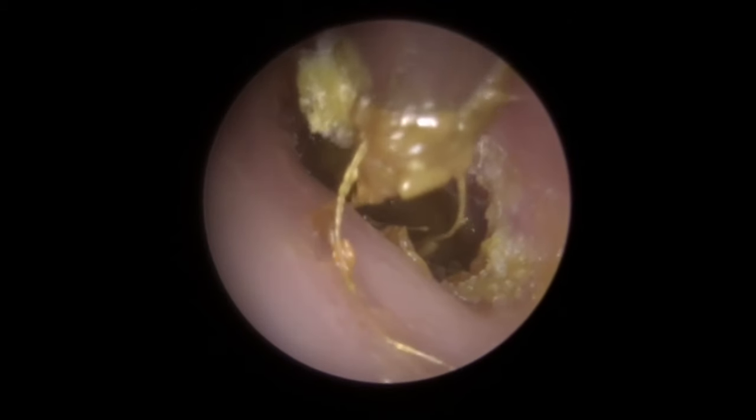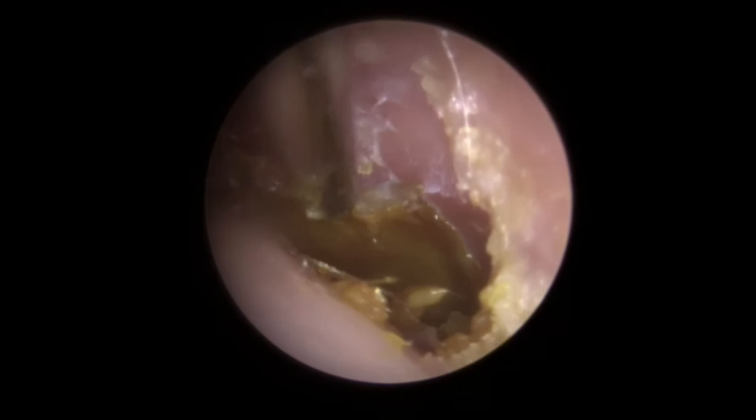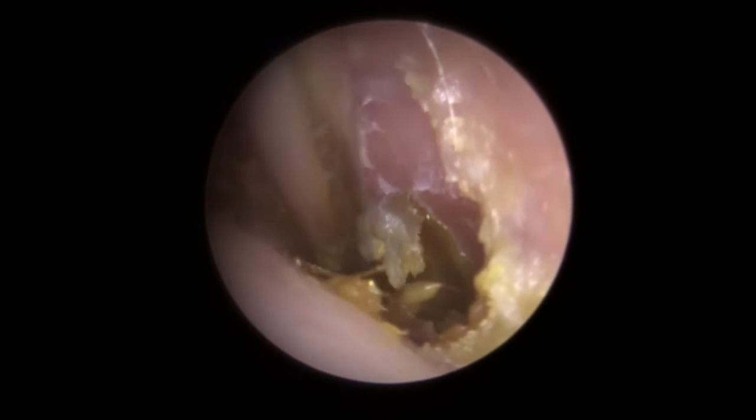So now we've broken that bottom section away — see the change in consistency? It looks a little bit wetter. Now that's what causes the problem for the last bit. When it goes wet, it tends to coat the canal wall, and in this case completely coat the eardrum. And it can sometimes harden or thicken a little bit. So we've actually got this section now covering the eardrum. We've got to be really careful with this — you can see it starting to peel away. There we go — just trying to lift, trying to find anywhere to lift from.